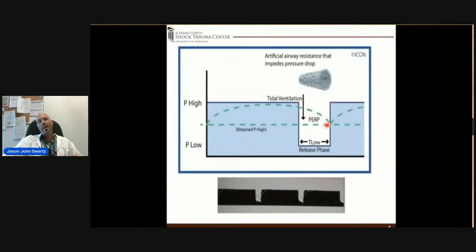Because you don't want to start playing with the 75, where you start the patient on APRV. 75, I'm stopping the release at 75. The volumes are so small. Maybe I should let it empty to 50 because I'll get a bigger gradient. Yeah, but you're going to be de-recruiting on the release phase. Never touch the 75. Keep the 75 always as is. You can start with a slope of 0.2.